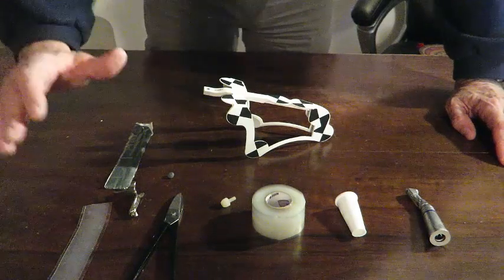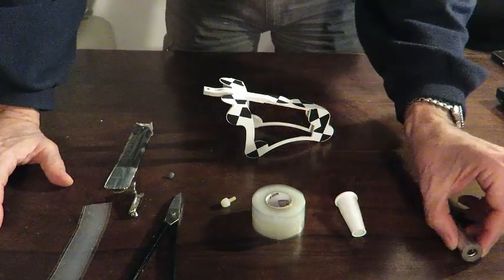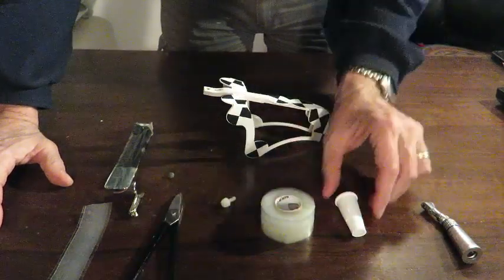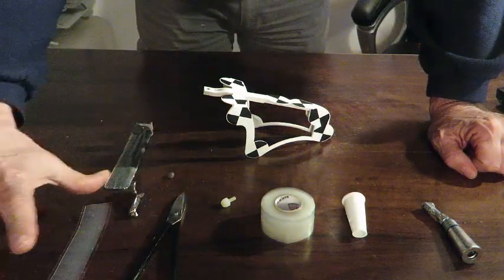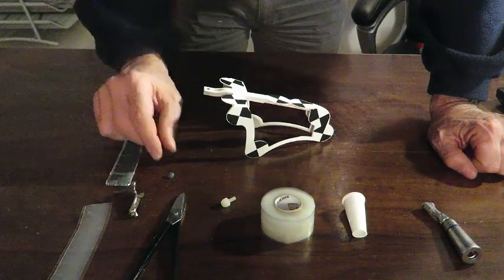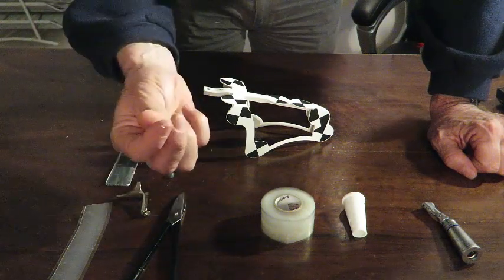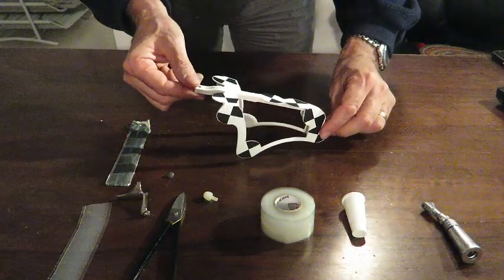What we need first of all: we need to prepare our table. We will need a contraangle, a silicone tape, a sleeve, a scissor, a stripe of the silicone tape like 20 cm, patafix, then the adapter, then we will have the screw, and then of course the drill tag.